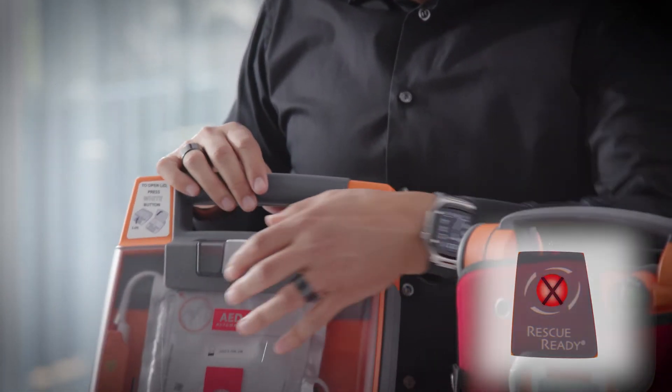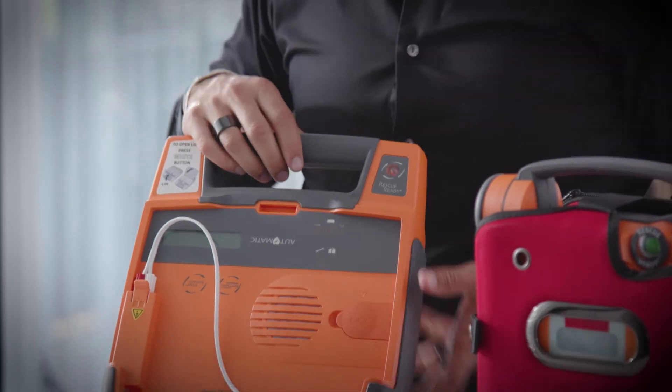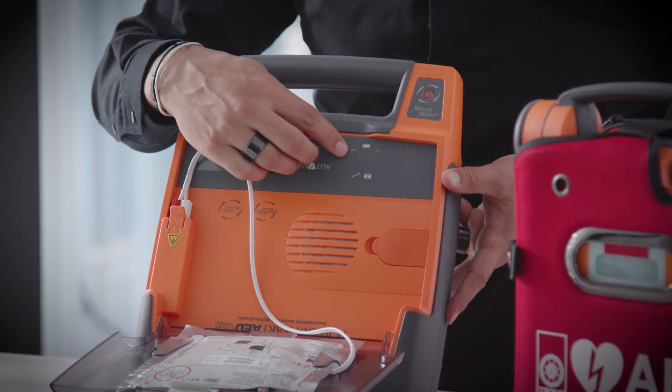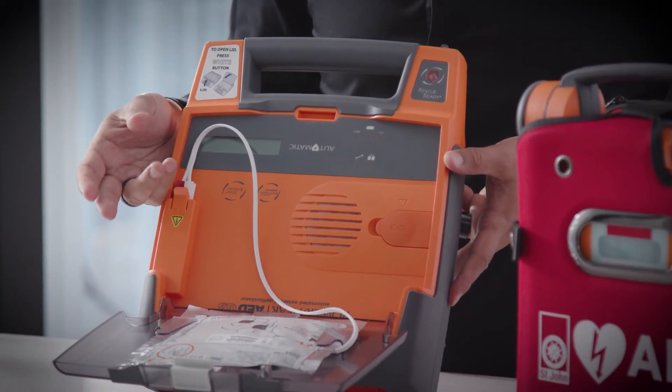You'll know when to change your battery when your device starts beeping at you. Your rescue ready indicator will be red with a cross through it. To figure out what the problem is, you open up the device — you have a series of LED lights on the display, and the battery indicator will be red. You'll also get a voice prompt saying that your battery is low.